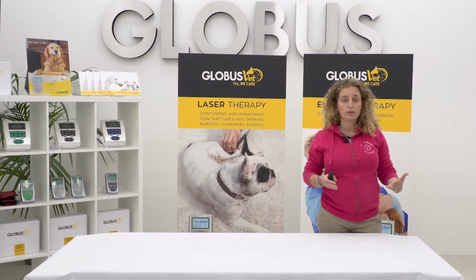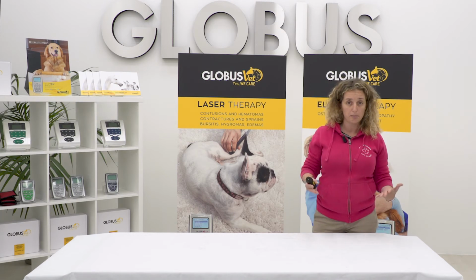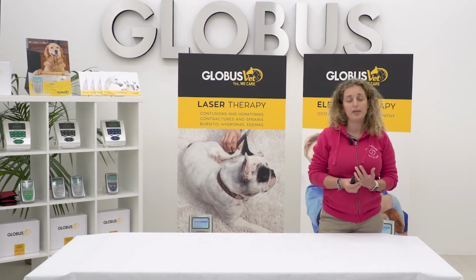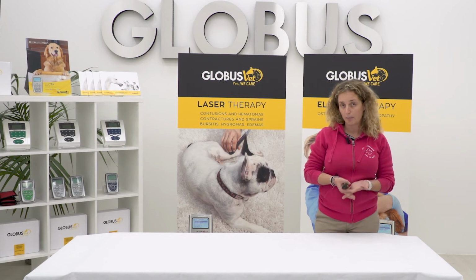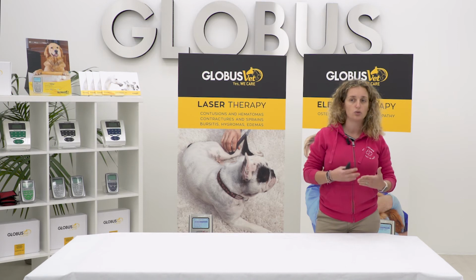We do not use TECAR on all joints, therefore also on the elbow, for a matter of time, because it is a medium-length application. With TECAR the duration of the treatment is 15-20 minutes, while with laser we speak of 4-5 minutes for an elbow, and we don't want to abuse the patience of our patient.